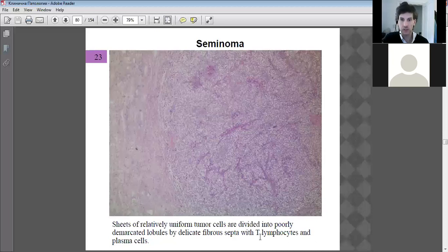Some necrosis there. T lymphocytes would certainly migrate towards the center of this to try and kill the necrotic tissue. You can see one example there of a lymphocyte. This is a neutrophil, very good example of a neutrophil there, multi-lobed nucleus. This is the lymphocyte. So neutrophils support the lymphocytic invasion, so the lymphocytes are making their way, trying to look for any macrophages. Can't see any as such, but I can see the lymphocyte there.